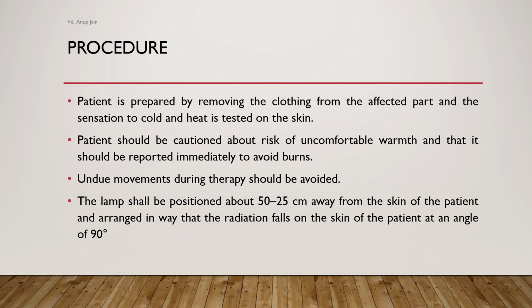The lamp shall be positioned about 50 to 25 cm away, according to the perception of heat, from the skin of the patient, and arranged in a way that the radiation falls on the skin of the patient at an angle of 90 degrees.